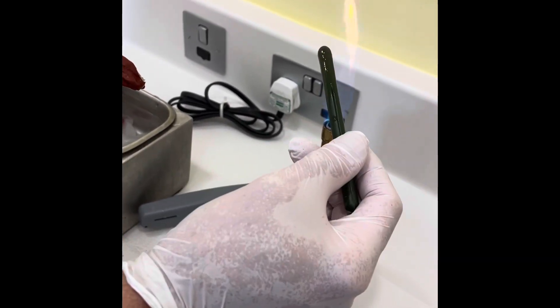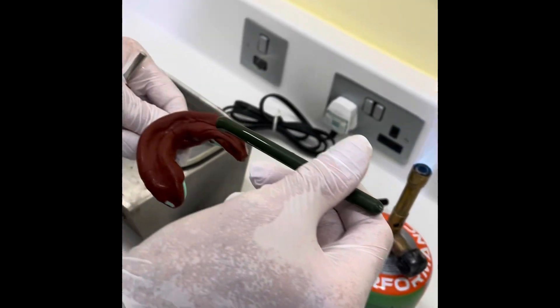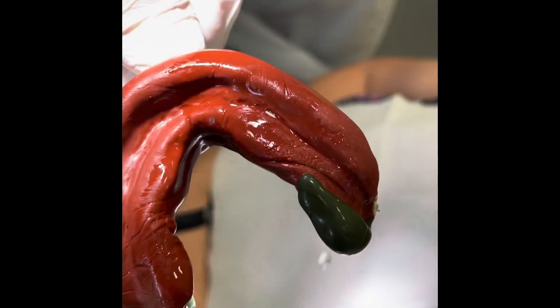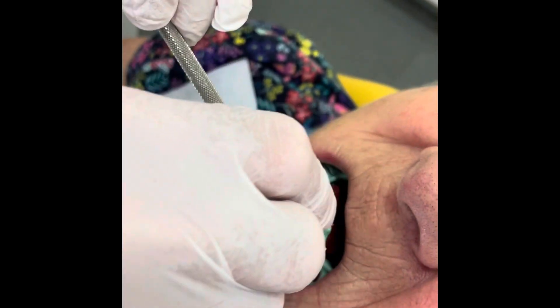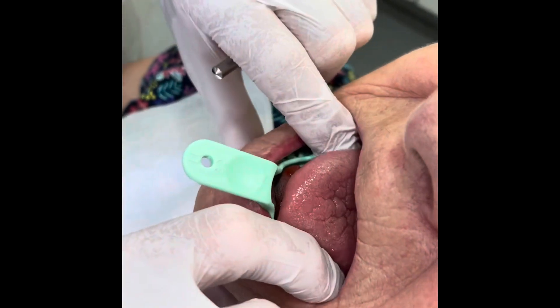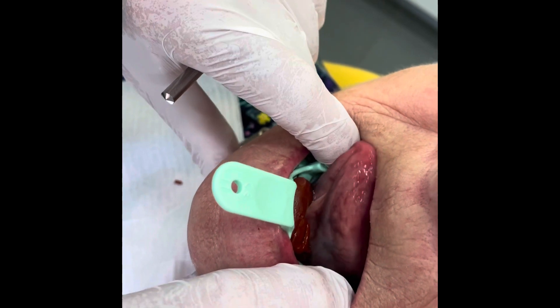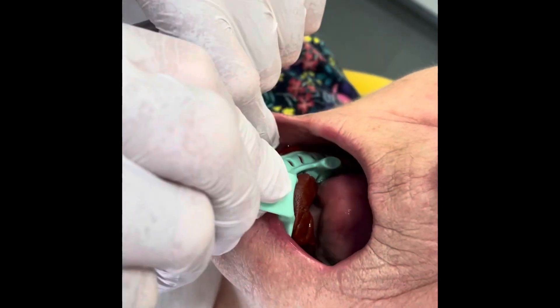You don't need much. I'm going to try this in — mirror to retract the tissues, fingers on the top, lick your top lip left to right. No discomfort. All right, take it out.